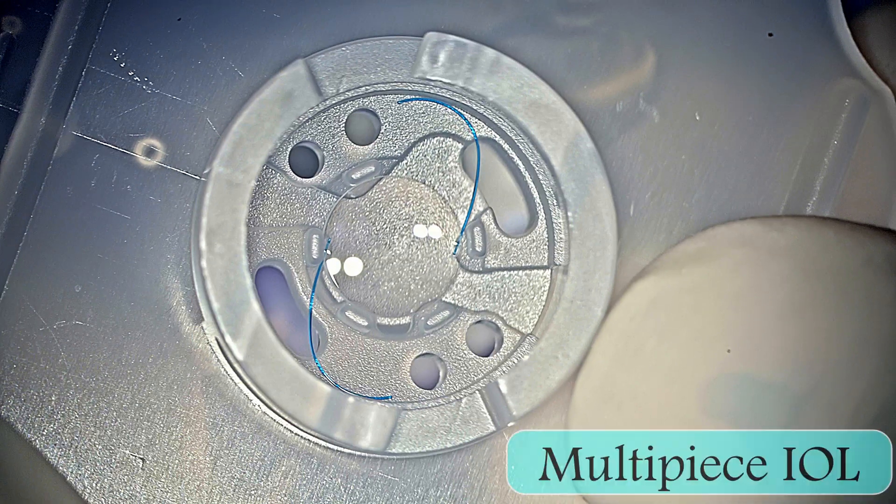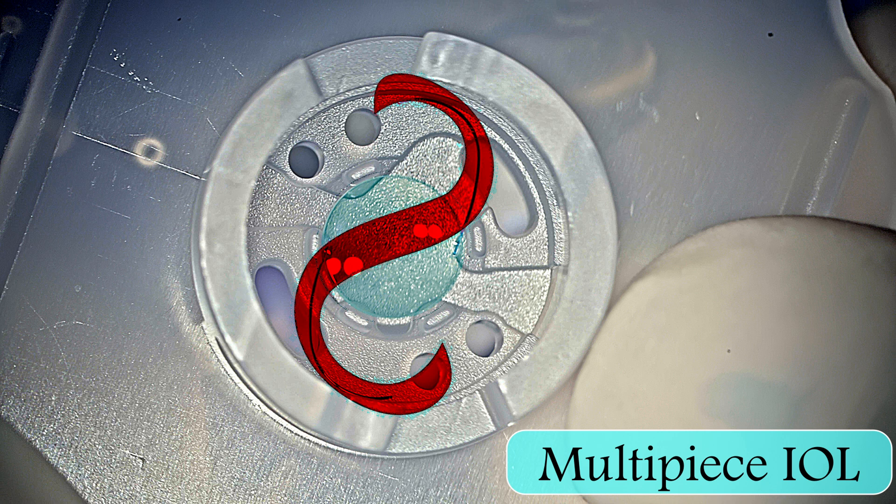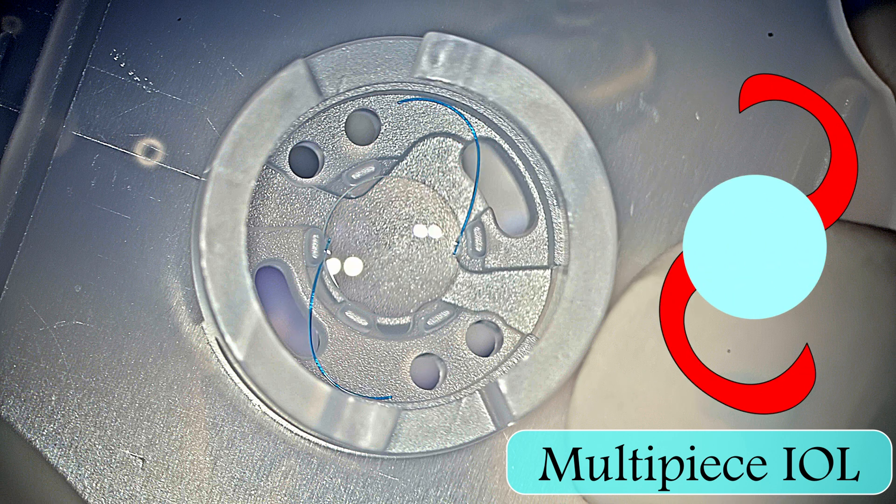The lens is held with the haptics in the inverted S-shape format, and this is how the lens is usually kept in the box.